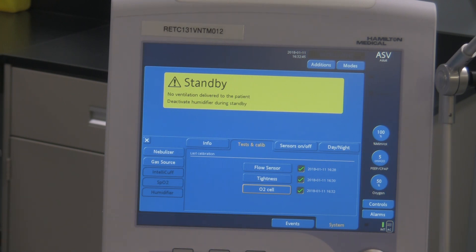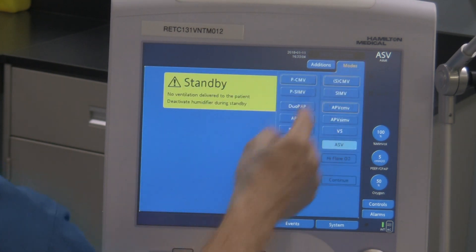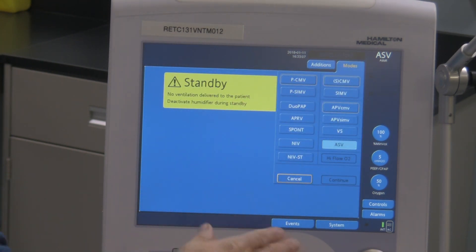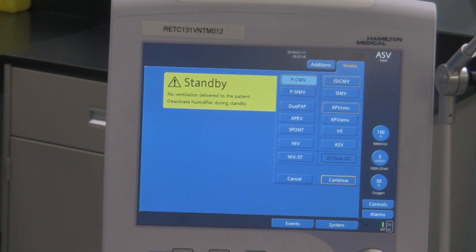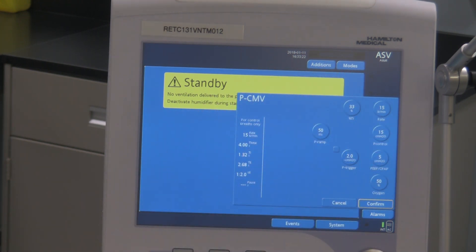Once you have done this test, if you want to get out of this menu, you can simply hit the X. That takes you back to the original screen you had when you turned the device on. If you want to go now and program any modes into your ventilator because you're going to ventilate your patient right away, bring up the modes tab right over here. That brings up all the choices of modes that you have. So if you wanted to pressure ventilate your patient in assist control, hit PCMV, hit continue, and now it brings in all the ventilation dynamics available on this Hamilton G5 ventilator for that specific mode of pressure ventilation.